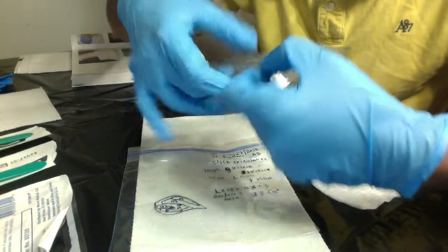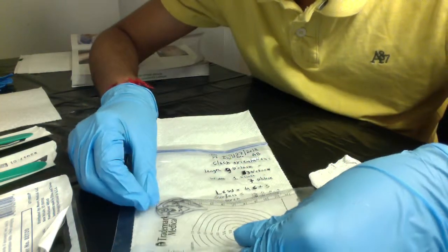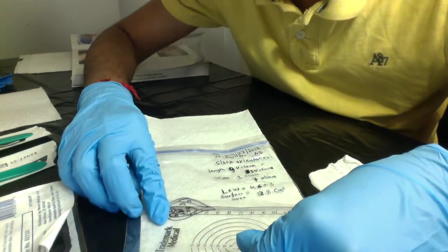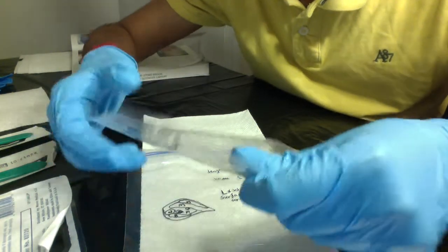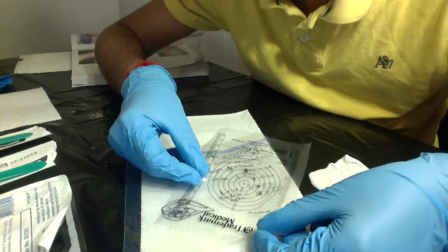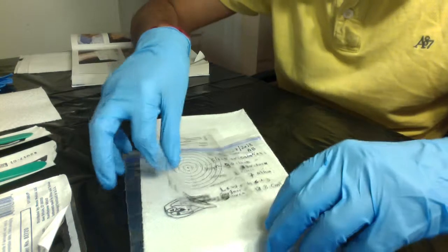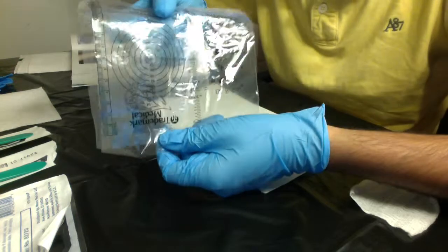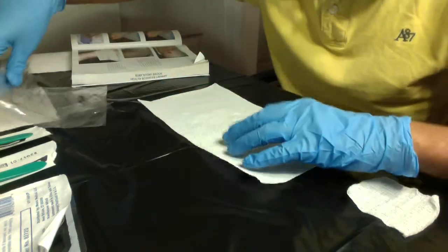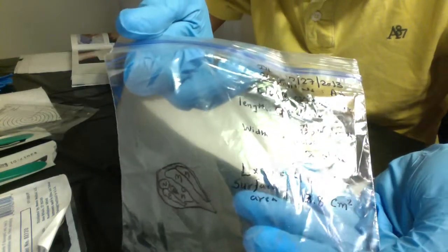Okay, this is the centimeter. So this is the length of the wound, which comes to approximately 4.6 centimeters, and the width is approximately 3 centimeters. The surface area calculation is done using these markings here, which is, as I mentioned, about 13.8 centimeters squared. Just showing you to scan the wound.